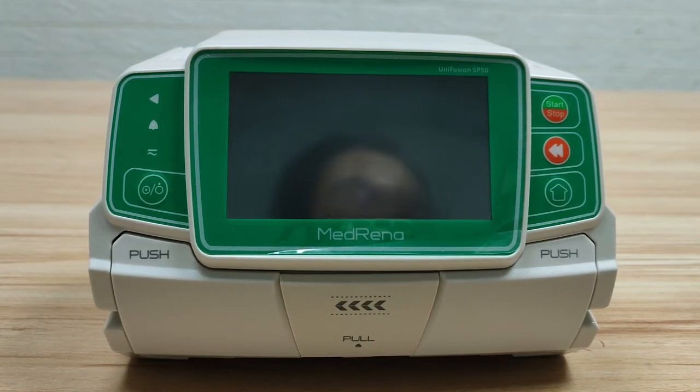This video introduces the basic operations of the four infusion modes of the MedRena infusion pump, model name Unifusion VP50.